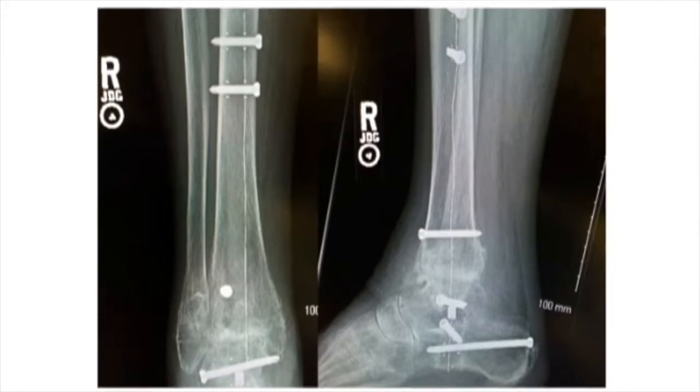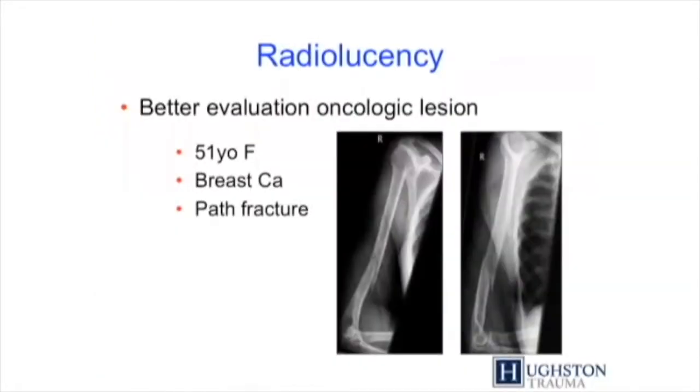This was at 8 weeks, and so you can see here that she had excellent beginning signs of consolidation of bone. And normally with the metal implant, I probably couldn't see the tibiotalar joint very, very clearly. But that, coupled with the fact that I was seeing excellent healing progression, her weight bearing was advanced a lot sooner, and she's walking normal now at a year out.